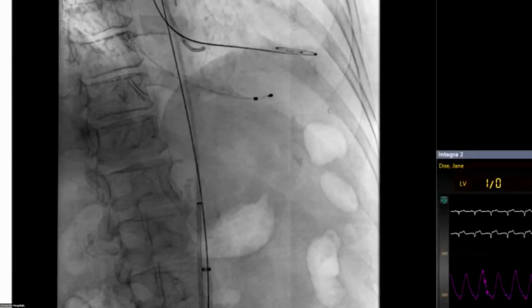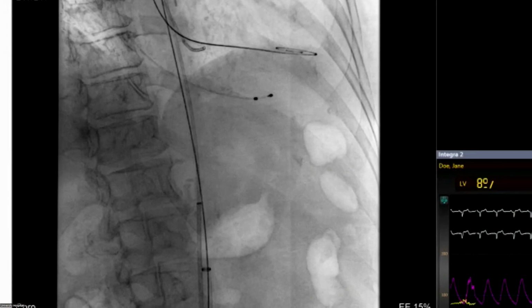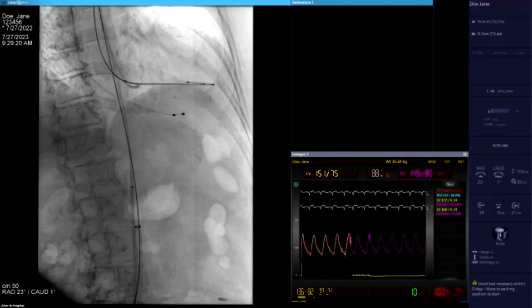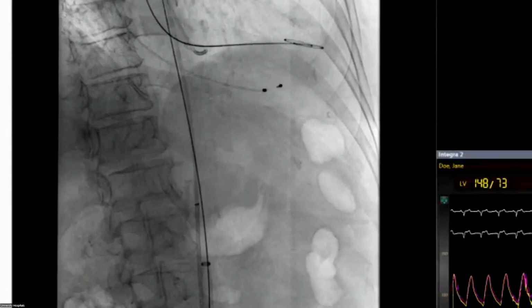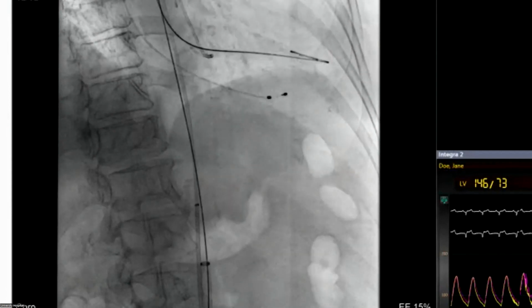Okay, I got the wire. All right. Is your pigtail in the femoral, or are you going radial with your pigtail? No, we don't go radial. It's interesting because we have our optimal practices course here, and I always tell people when they come here, you can challenge me about any step of the procedure. I will justify why I do things and why I don't do some other things. The reason why we always go transfemoral with the pigtail: number one, the vascular complication rate of going transfemoral for us is extremely low with the secondary access. Number two, if I need to use a buddy wire, Lunderquist, for whatever reason, if I am going radial, I'm going to lose that opportunity.